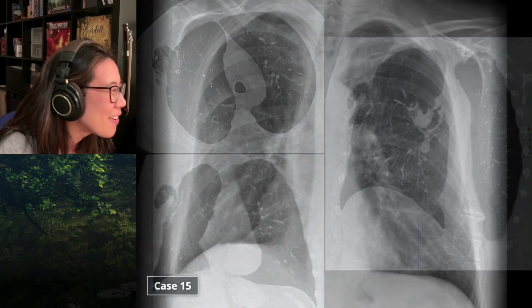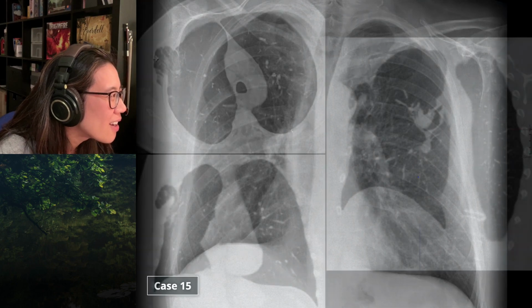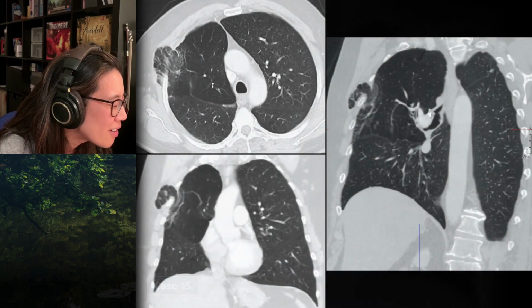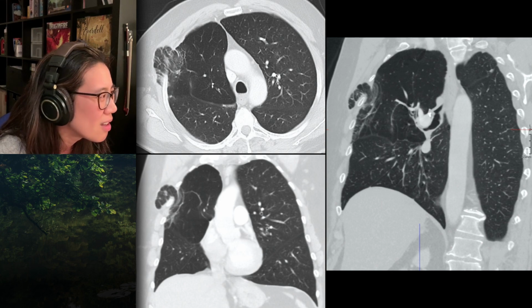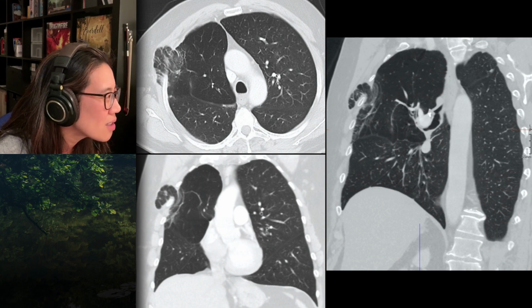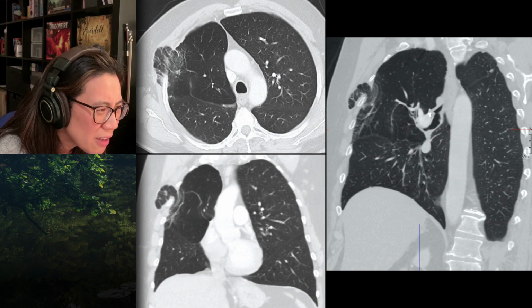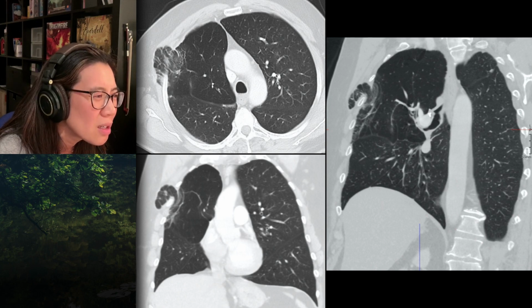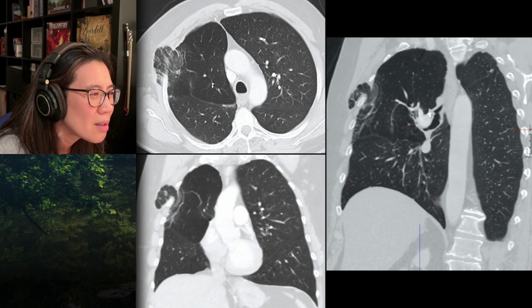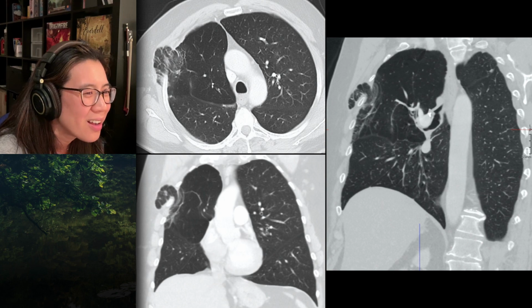Let me go back. It's intermittent. It comes and goes. So what's he got there? He's got lung herniation, through a surgical defect. He's had a thoracoscopic VATS lobectomy, and that's one of these port sites. So he's got a lung hernia through the port site, which interestingly comes and goes.